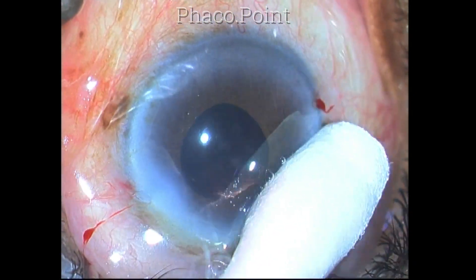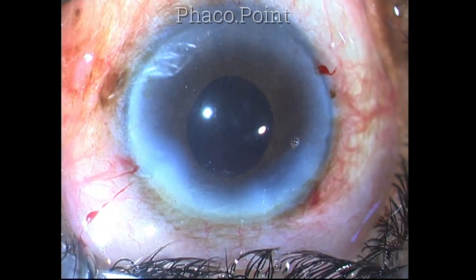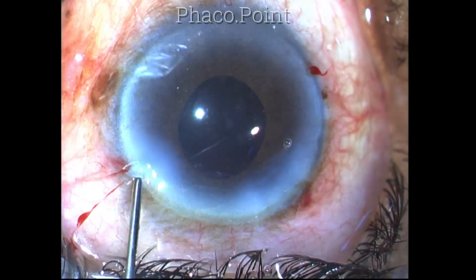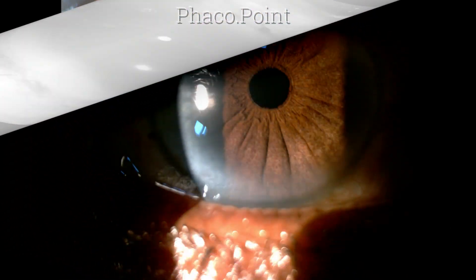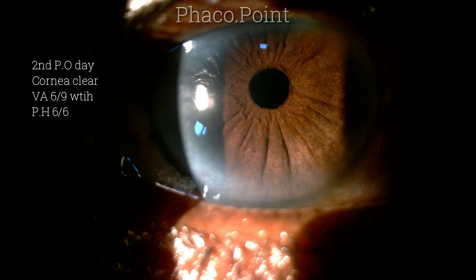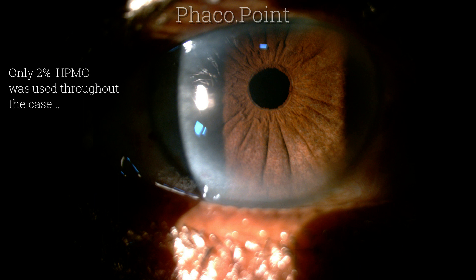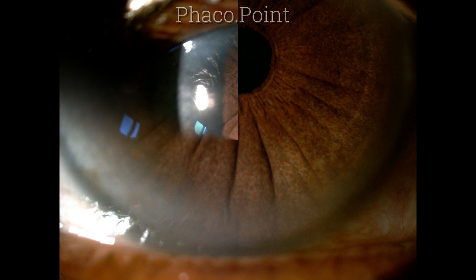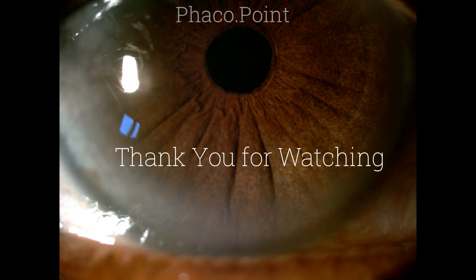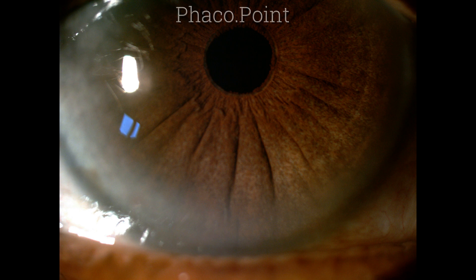This patient was operated on a Saturday and was seen by my resident on Sunday, who noted mild central superficial keratitis. However, when I saw the patient on Monday morning, the cornea was crystal clear, there was no anterior chamber inflammation, and the unaided visual acuity was 6/9, improving with pinhole to 6/6. The only problem was when I tuned the phaco handpiece for the next case, I found that the handpiece had died. Maybe it was coincidence, or maybe the crystals simply could not handle this grade 6 nucleosclerotic cataract. Thank you for your attention.